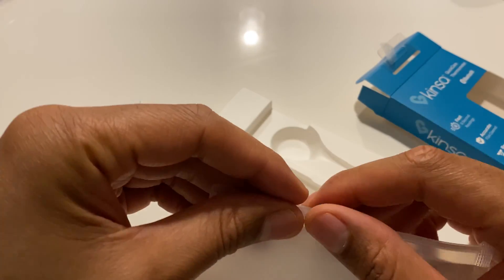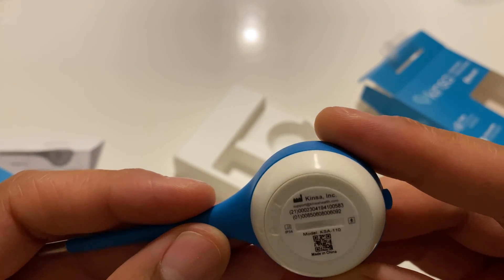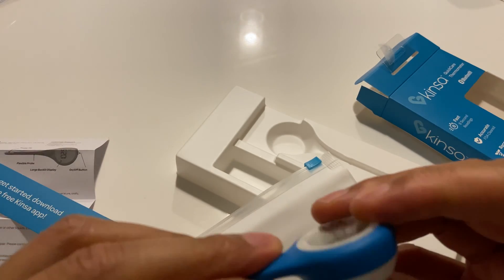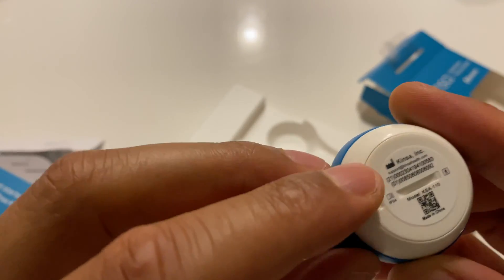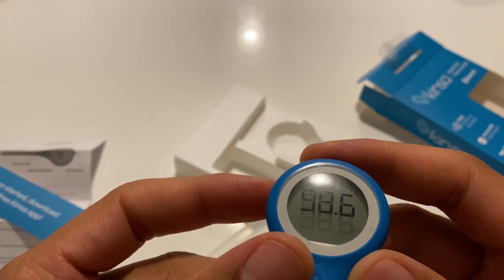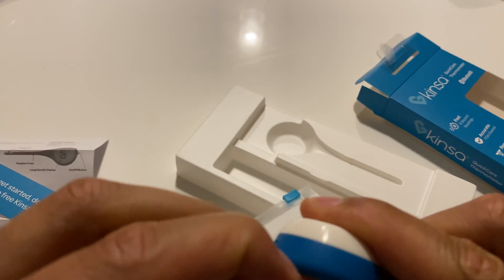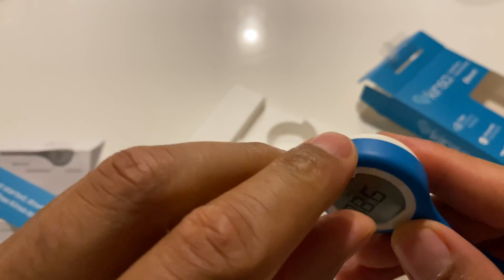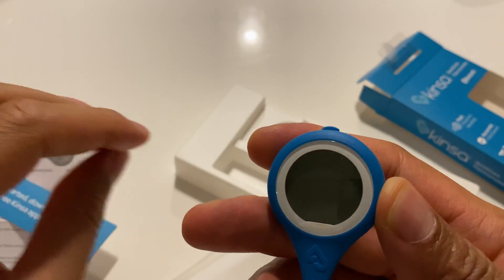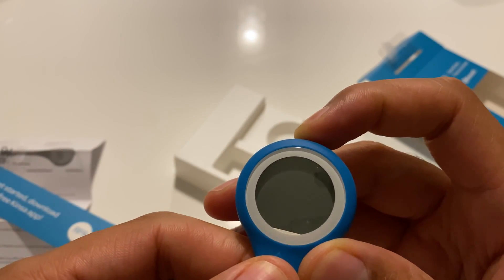Kinza — feel better. So I'm going to go ahead and open this up. I'm guessing this is where the batteries are located underneath there. Just twist and open it up. It says 98.6 degrees — I'm guessing that is the standard temperature of humans. I'm going to take this and peel back the plastic protective cover. There's a button on here at the top; that's the on/off button. I'm just going to go ahead and press that.